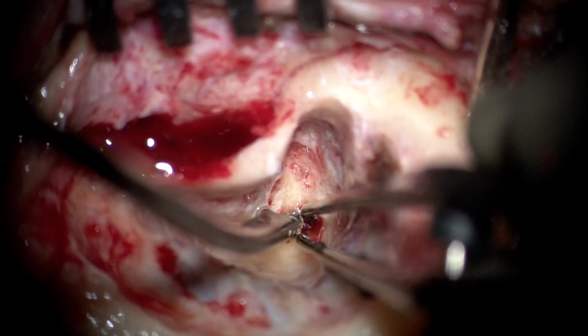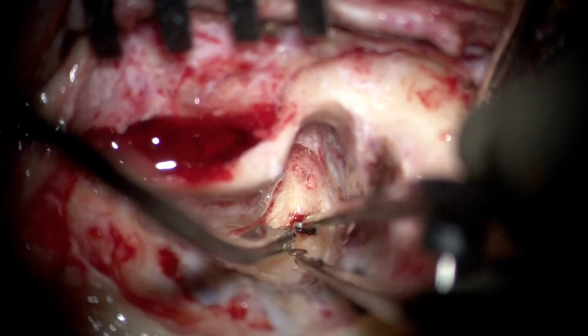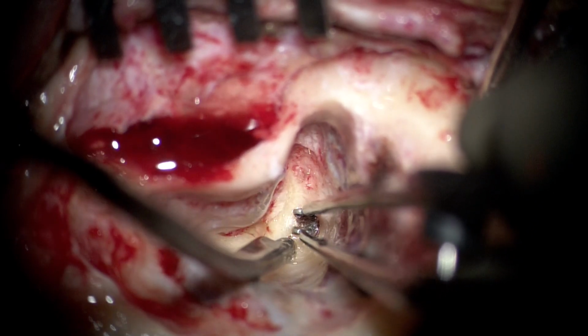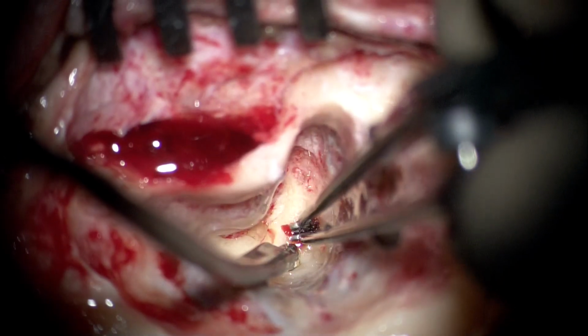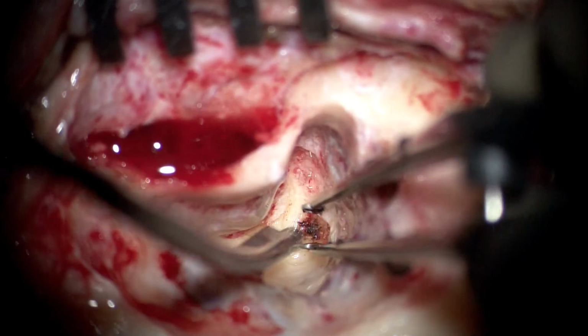From the vestibule, one can see the shadow of the vestibular aqueduct or the endolymphatic duct, which is the bony duct carrying the endolymphatic duct, which comes posteriorly towards the posterior fossa dura and then takes a bend inferiorly.